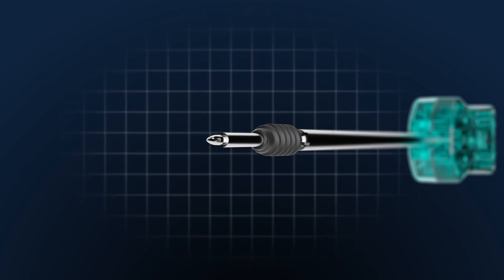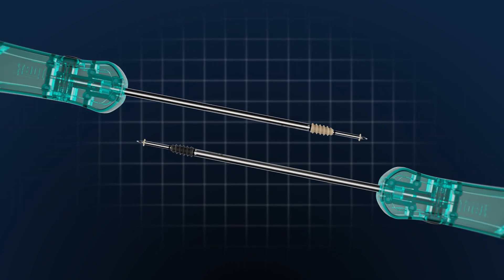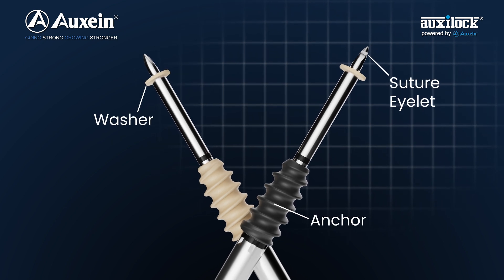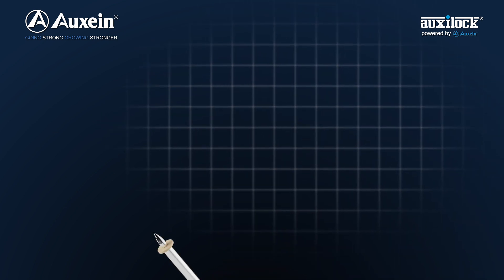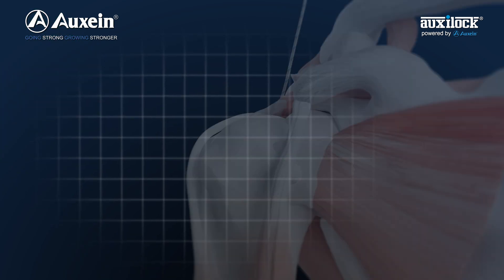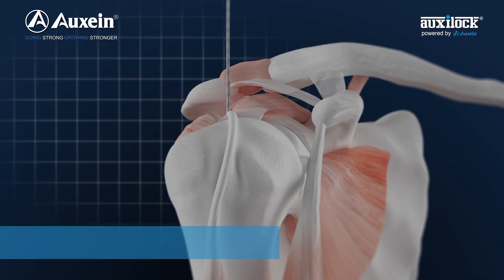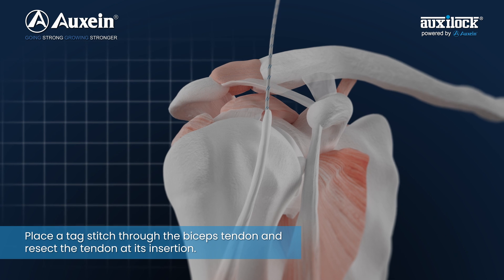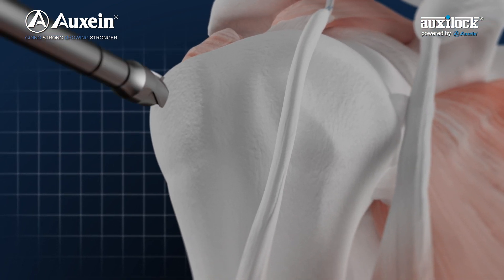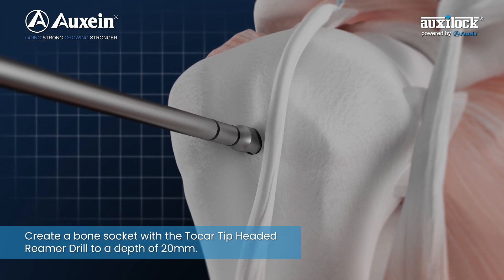Welcome to the Biceps Tendon procedure. Resect the tendon at its insertion. Create a bone socket with the trocar tip-headed reamer drill to a depth of 20 mm.